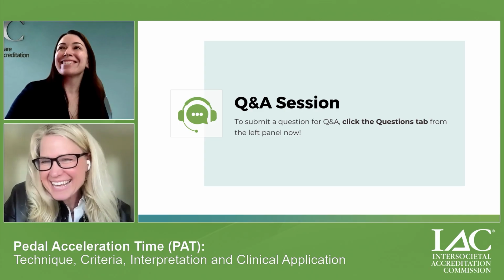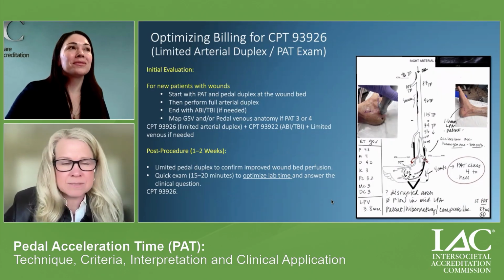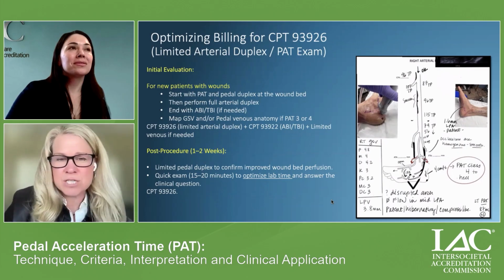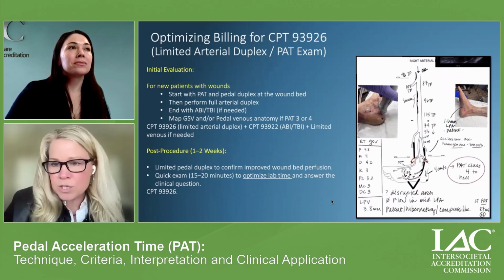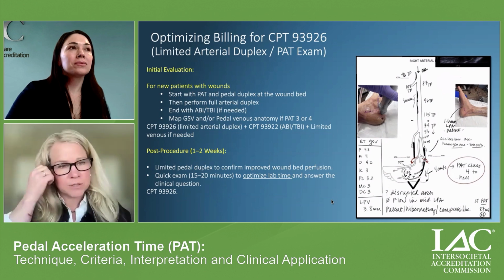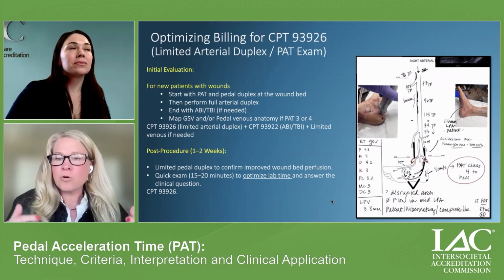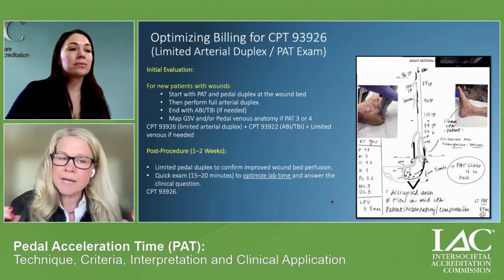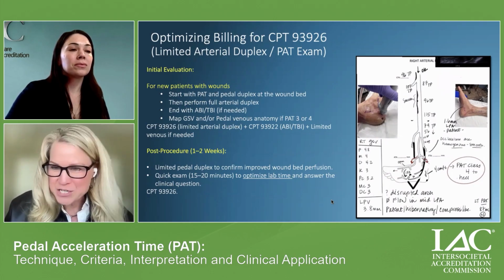So the algorithm that we use in our lab that worked very well for Dr. Tesso and other physicians that I work with is that on the first examination, we do the full arterial duplex because we are mapping for intervention. Patients always come back at that 1 to 2 week mark for an initial follow-up. And that's where I think that limited pedal duplex can be really helpful. We just want to know, is the blood flow improved after intervention?